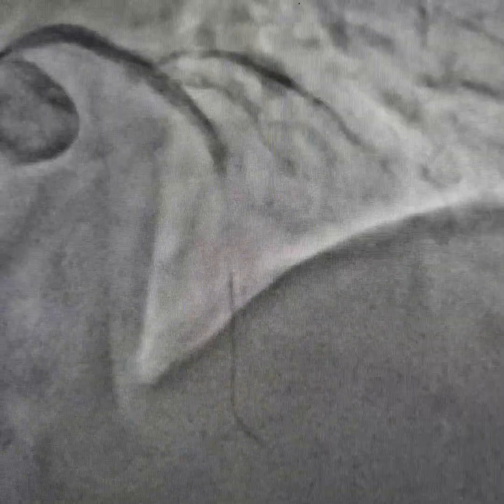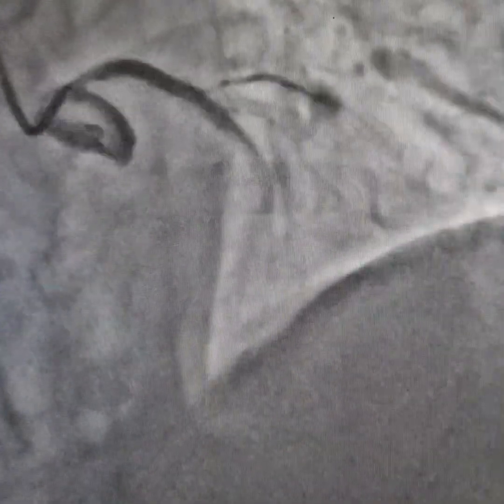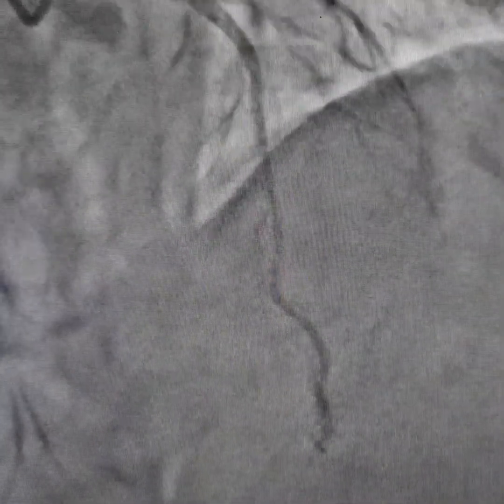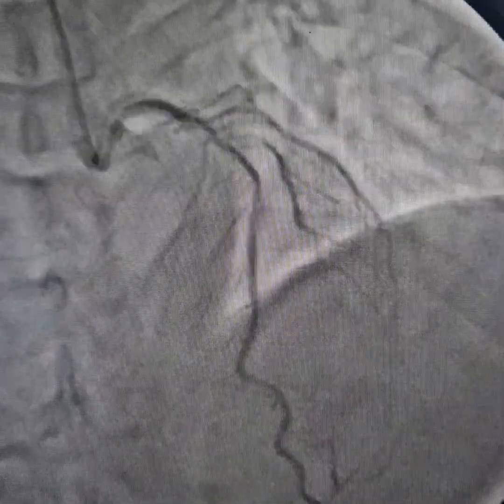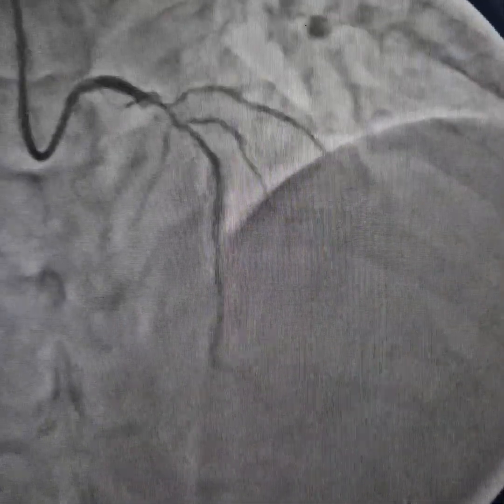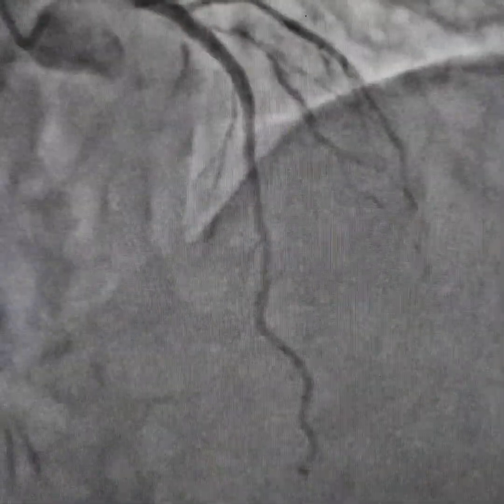The patient was very thin and fragile. This is the final view and overall very, very good results, as you can see. If I just go back and show you how the artery was, then maybe you can appreciate it a little more. This was the initial artery and this is the artery now, and I think we have done a fairly good job.